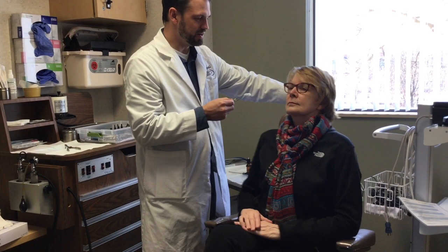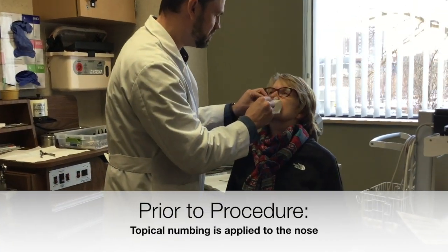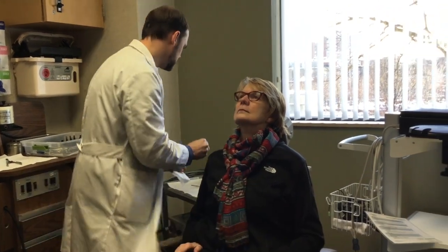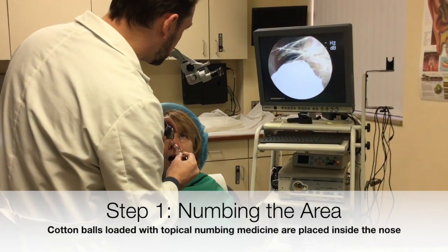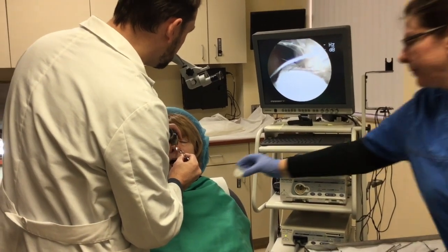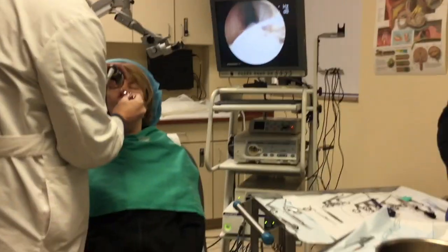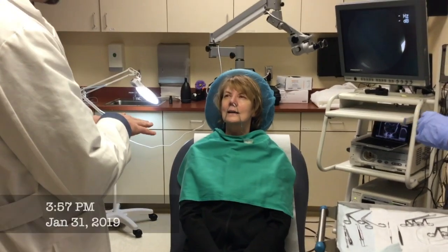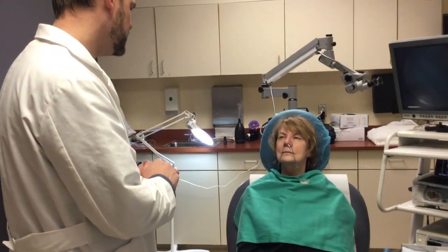So just rest back here. I'm going to cover your mouth so this doesn't drip into your mouth. It's got the numbing medicine on it. Just put a cotton ball in your nose there. Right here. We'll let that wait for just a few minutes, and then I'll be back in about 5 minutes, and then we'll put the numbing medicine in there.